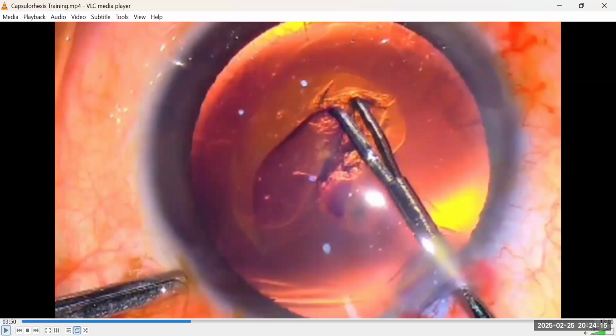And each flap has a base. If I had done 2 clock hours and I stopped, there is no wisdom in going back to pick the tip of the flap because I will only continue the radius. And the law of physics is still pi r squared. So if I'm going to regrab any flap, I go to the base of the flap and regrab it. So let's go ahead.